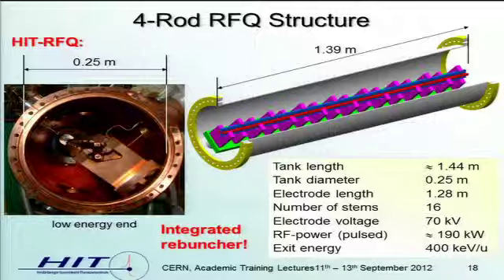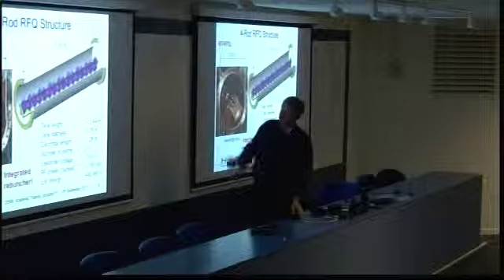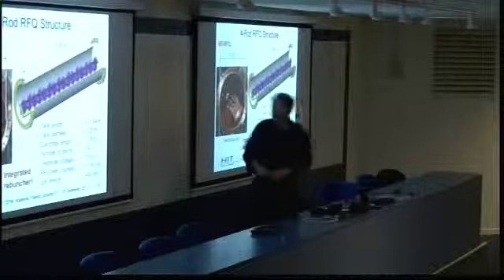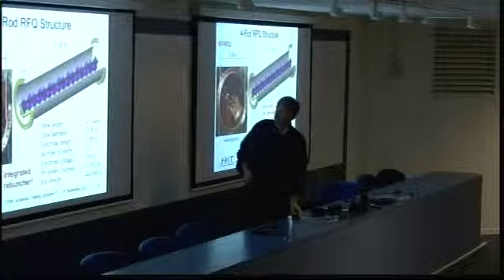Well, nevertheless, it took us a long time to bring it into a good operation scheme. And at the moment we are working on a new version, because the first one which was built has some drawbacks, mechanical ones, and so I think we will have the new structure in by the end of next year, just to have a better transmission. Today we have only 30%, and 60 to 70% should be possible, and we will do that.